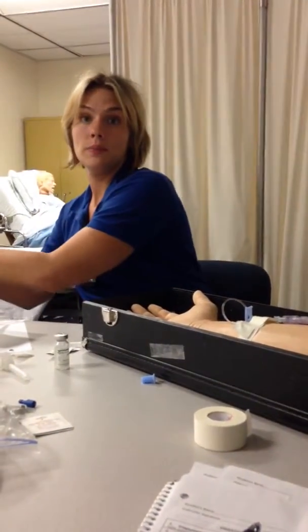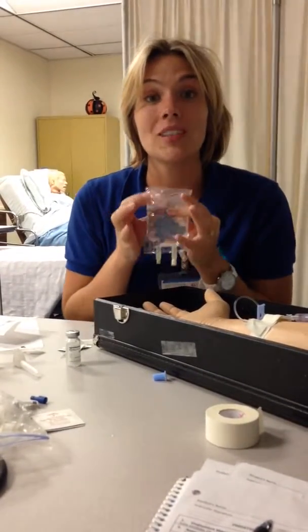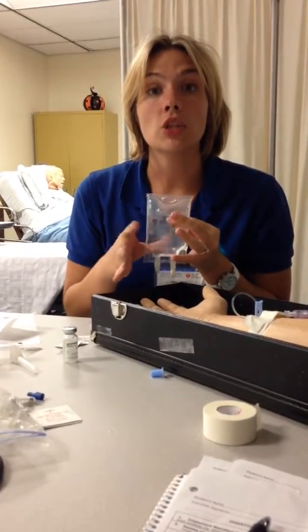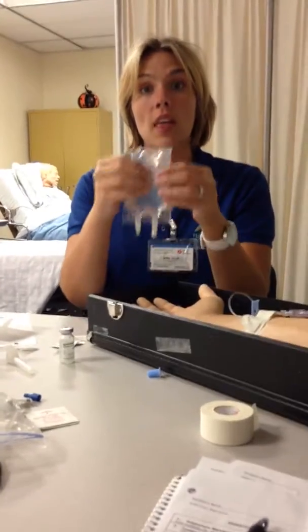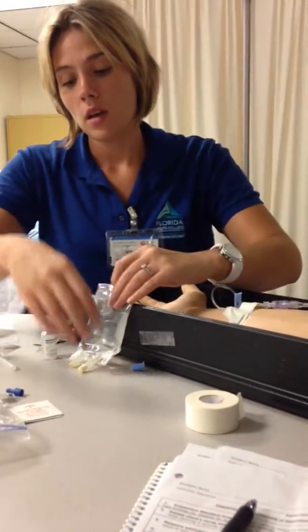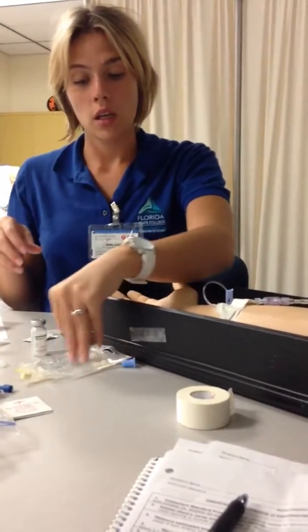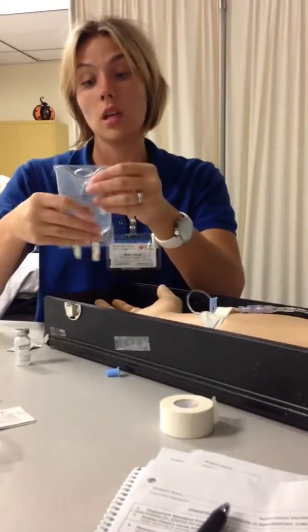I'm going to move this around. I am going to label this. This needs to have my patient's name, the time, the date, my name, my initials, the time and date, the drug, the dose, and the administration. So now that the medication has been pulled up, I am ready to go to my patient's bedside, but I need a way to get my medication to my patient. This has been labeled, it's ready.